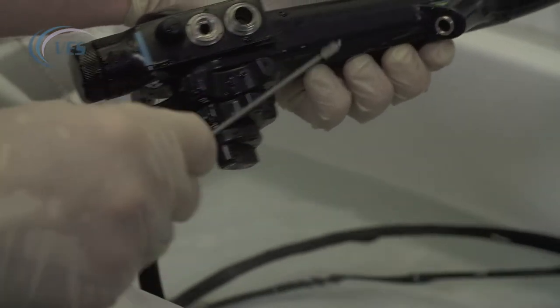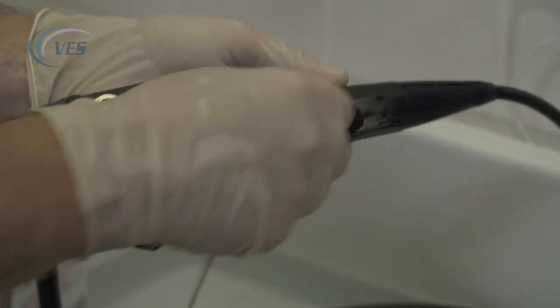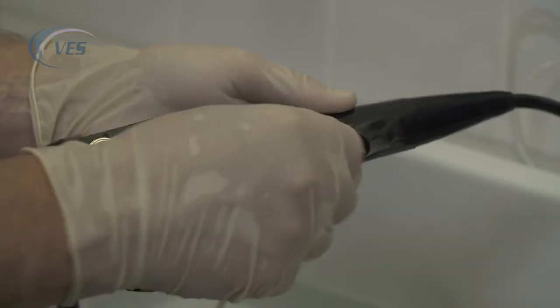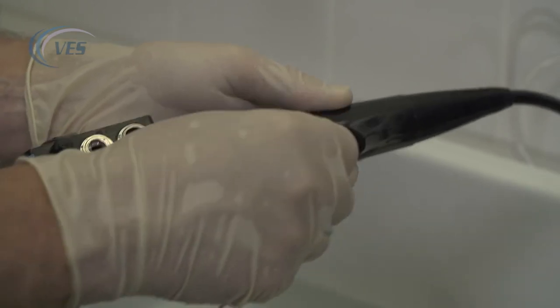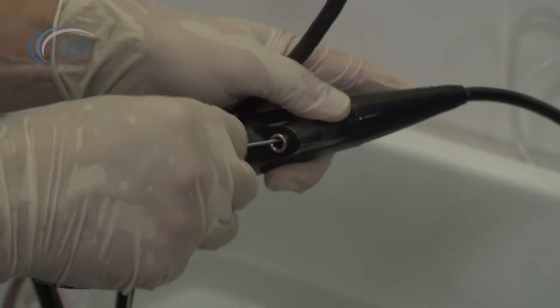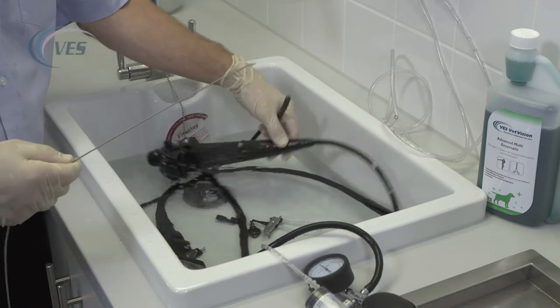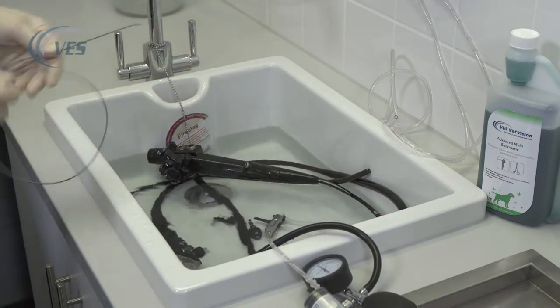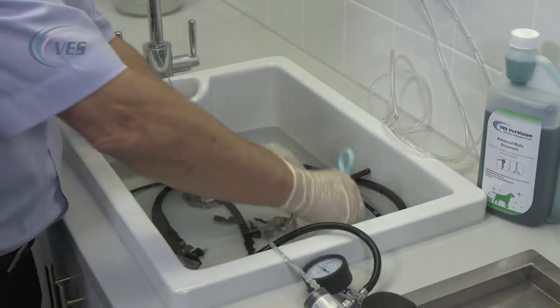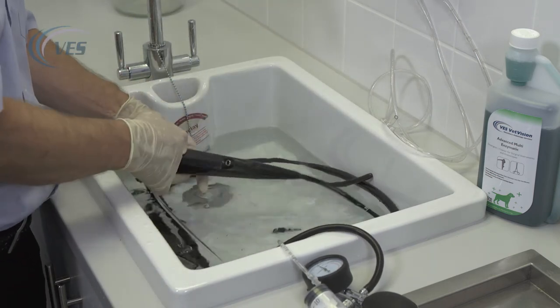The final port is going to be through the biopsy port, and again short movements. Keep an eye on the leak tester throughout the procedure to make sure that it doesn't drop too far. And there again we have the brush coming through the distal tip. We then need to reattach our flushing adapters.